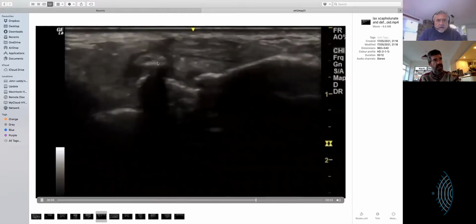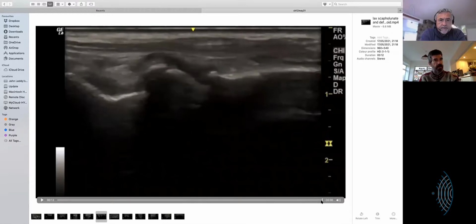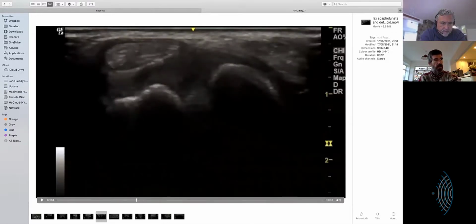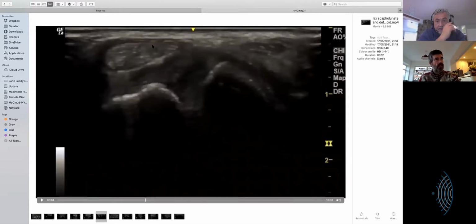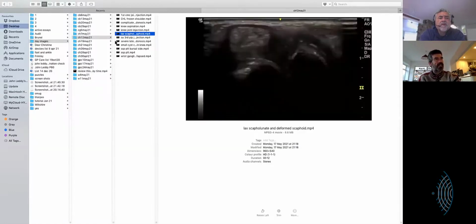That's an abnormal looking scaphoid, and then if we drag that back, that's quite a wide looking, mobile scapholunate joint. So the extensor digitorum above that, and there's quite a bit of fluid around that area too. Yeah, but no discernible ligament. So a little bit of instability there.